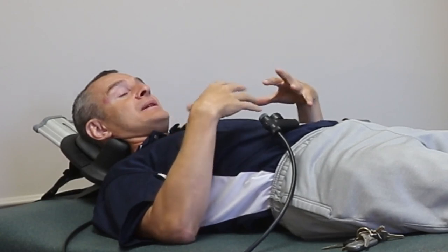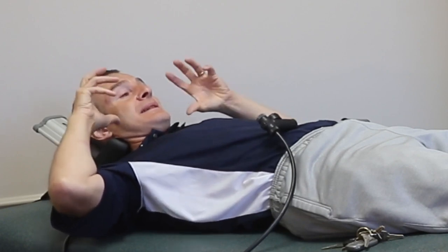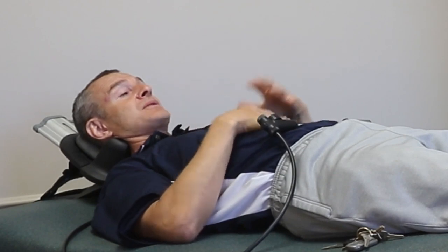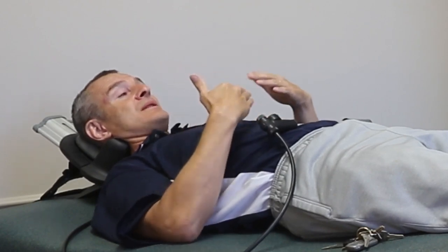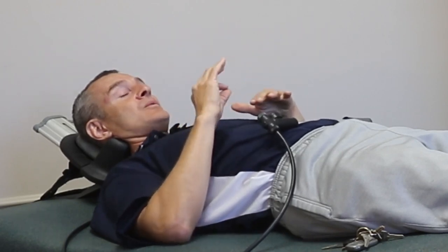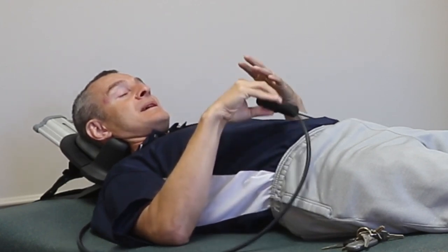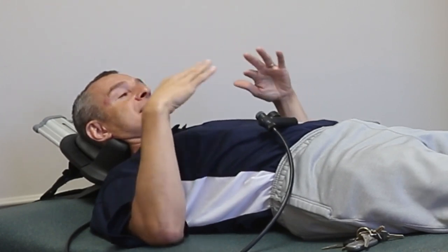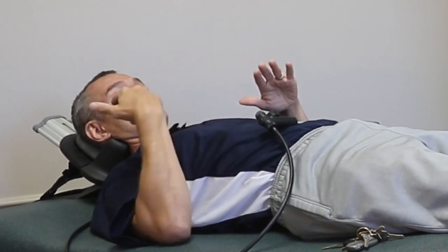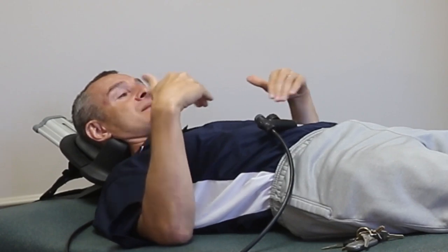For me right now, I feel a little bit of distraction. You might have seen my head tilt up and my chin fall back just a little bit. Sometimes you might have heard chin tucks or cervical traction. That's exactly what the machine is doing for me, but I can relax into this position. And quite often what'll happen is you'll start and it might read 5 pounds. But as I relax and as I settle down, and sometimes as I fall asleep, the gauge will start to move up, not because the device is applying more pressure, but because my body is settling down into position.